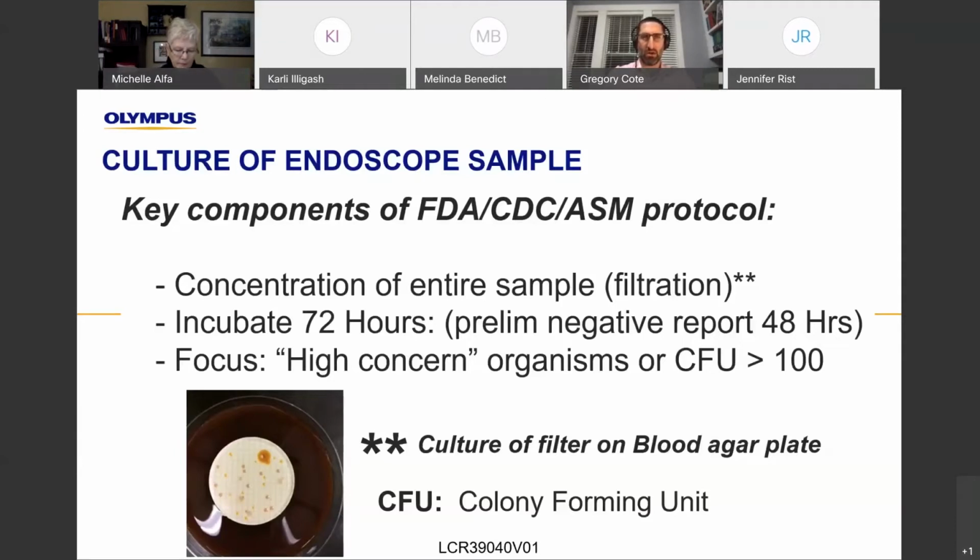We've had in our unit, we typically will have individuals from our infection control team, so they have nothing to do with our endoscopy unit, that come and obtain these samples. Now, they're not familiar with the equipment, so then you still need your technicians there in our reprocessing suite, to help them just with the scope handling and so on. But the actual process that Michelle described would be obtained by someone who's trained specifically in procuring these samples.